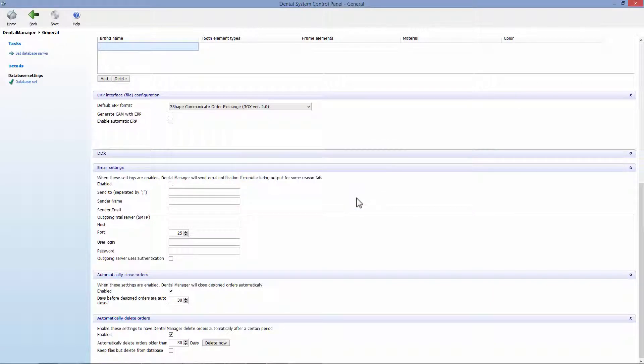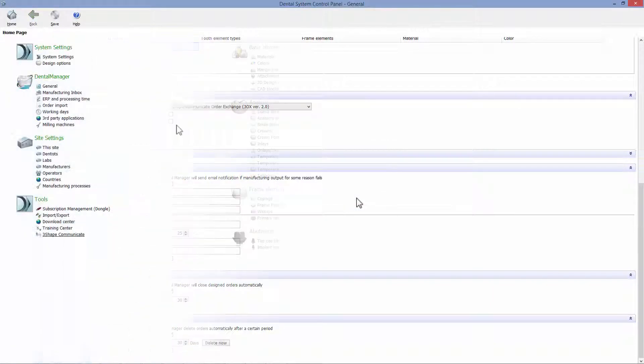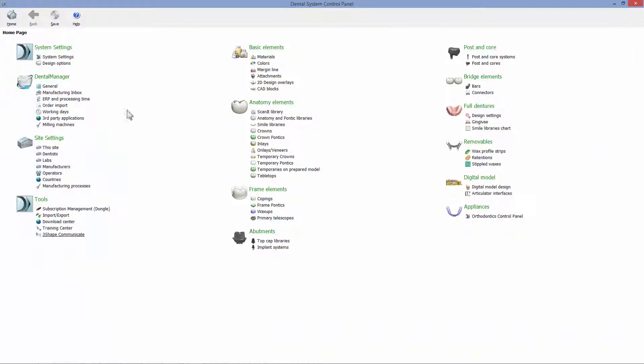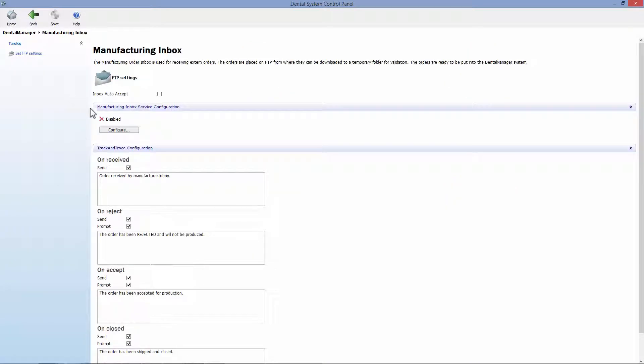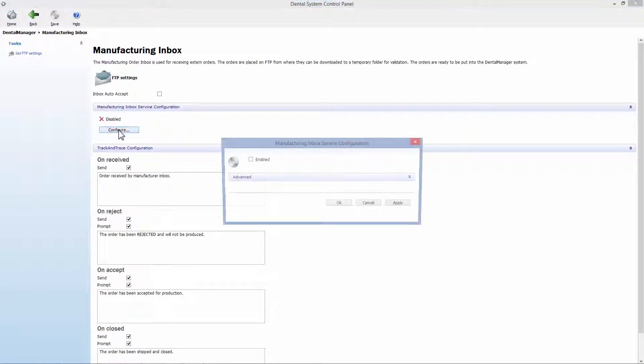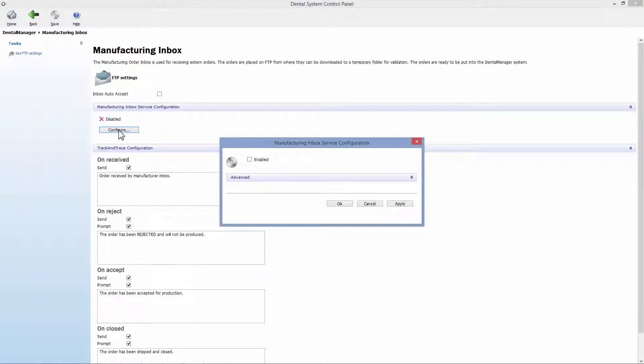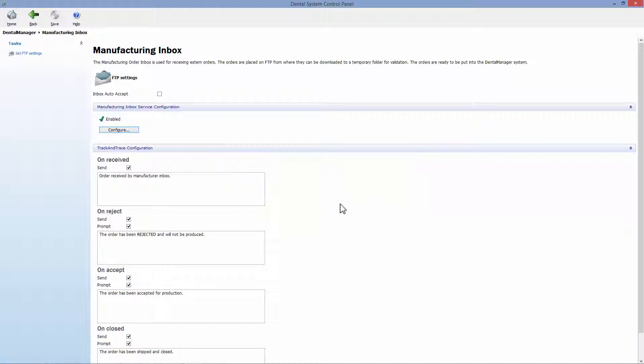You're able to use Inbox as a service. Go to Control Panel Manufacturing Inbox and then click configure in the Manufacturing Inbox Service configuration tab. This prevents freezing of the dental manager when orders are being processed in the Inbox.